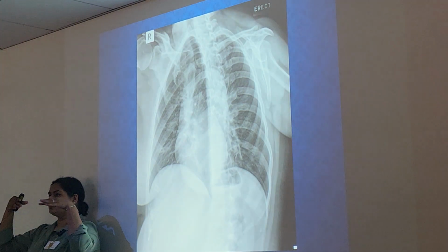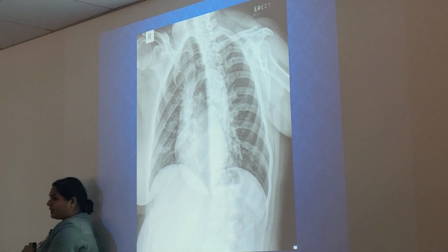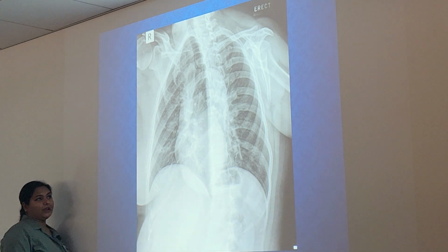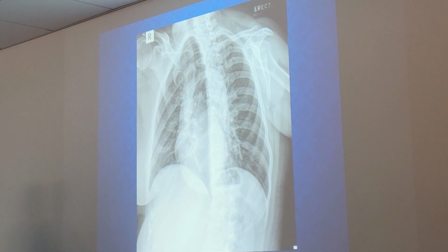Here, in a posterior oblique of the ribs, the side that touches the IR is elongated. In anterior ribs, the side that's away from the IR is elongated. So the right side's down, the left side's down. That's what I thought.